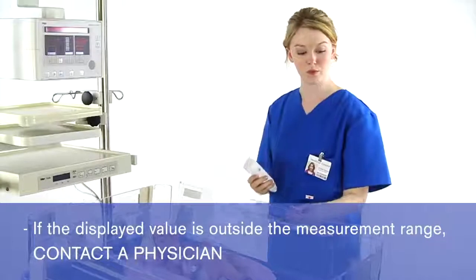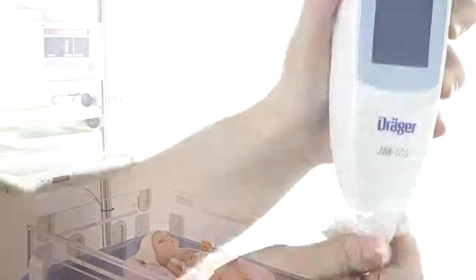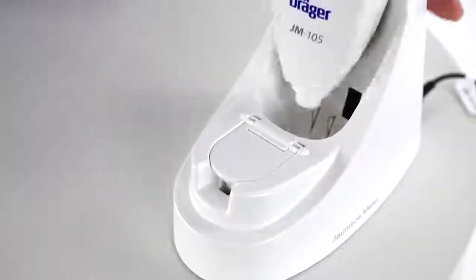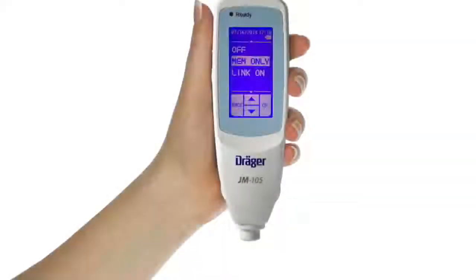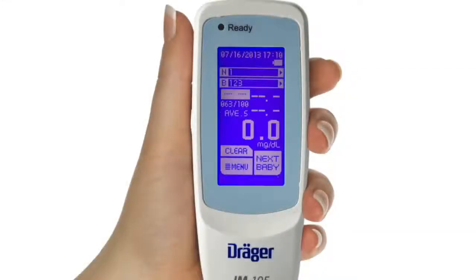If this happens, you should contact a physician immediately. If no more measurements are needed, clean the probe with an alcohol swab and return the JM105 to the docking station. In memory only or link on modes, if you are going to take a measurement on another baby right away, you can press Next Baby, clean the probe, and proceed.